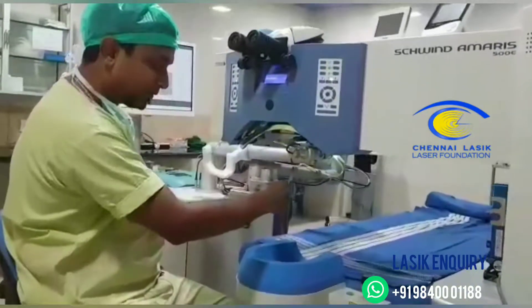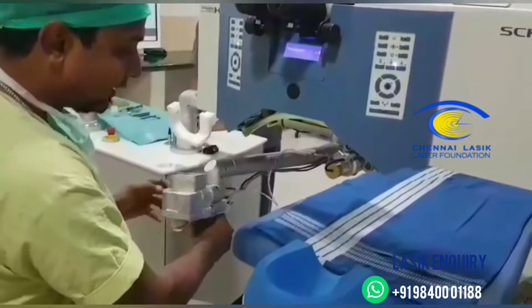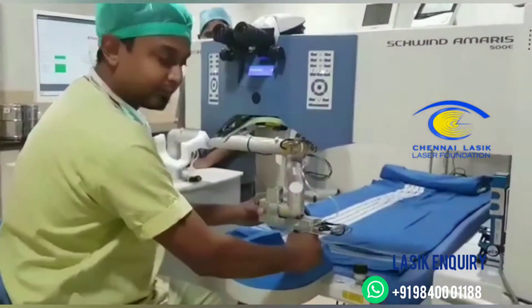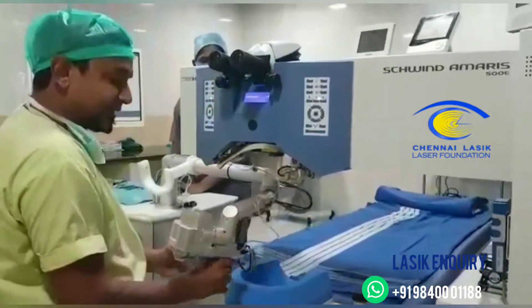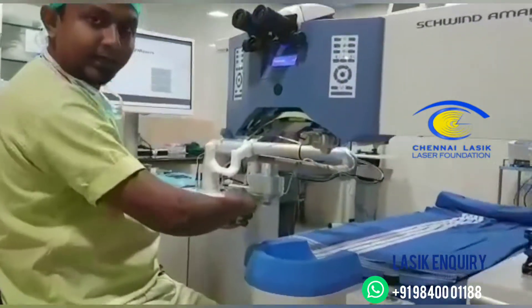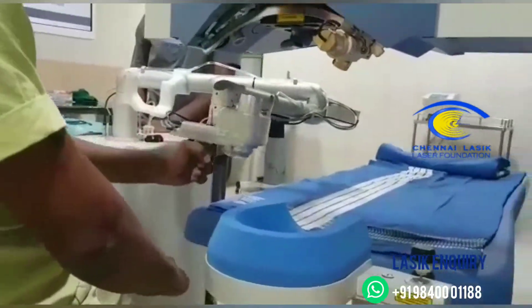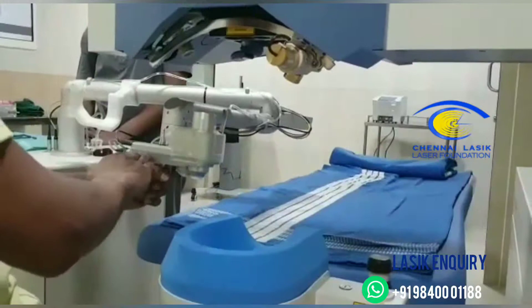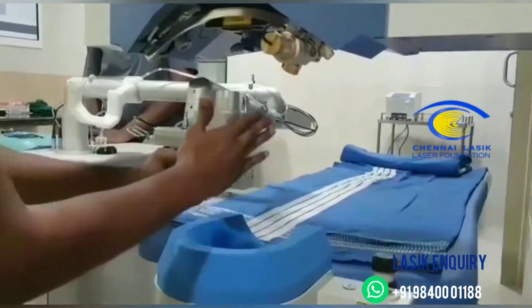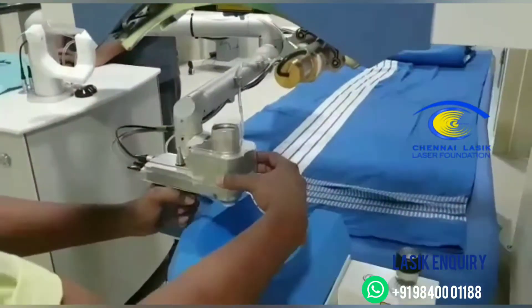The placement for the left eye will be in this way, and for the right eye all you have to do is change the machine direction and applanate. A few things to be noted while applanating a patient: the handle should be parallel with the ground level — it should not be tilting either way. Make sure the handle is parallel, then ask the patient to focus on the red light shown from the machine itself, and start going down to applanate.